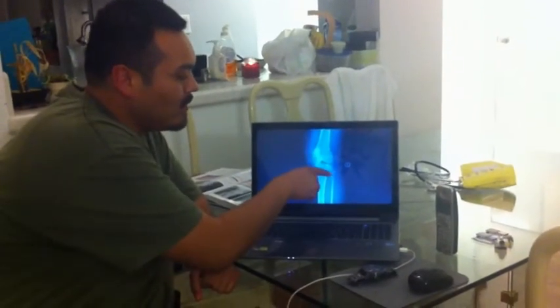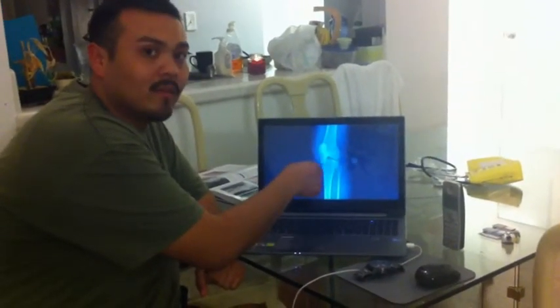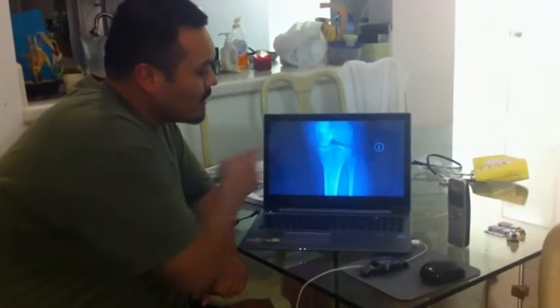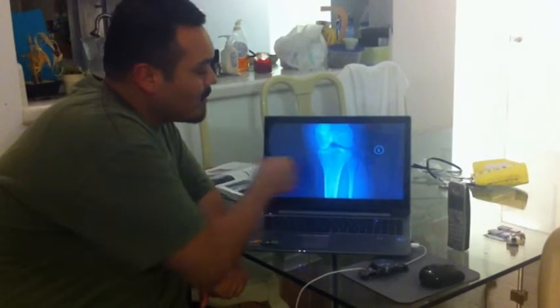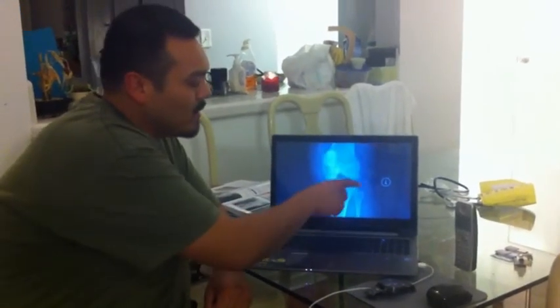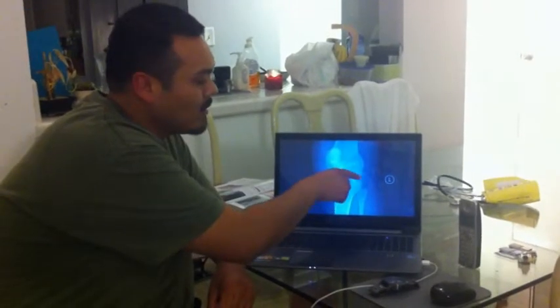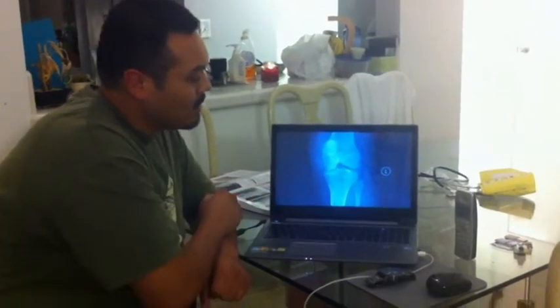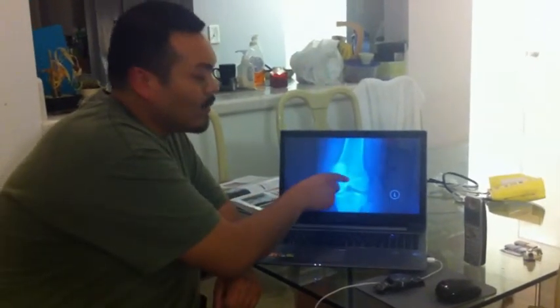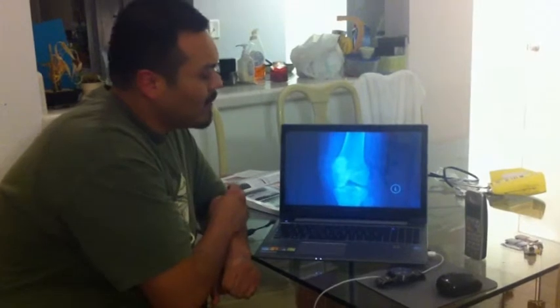of the tibiofibular articulation joints, which would be this one right here, and you can see it fairly clearly. You got your tibia here, your fibula here, and then you have your articulation joint coming right in here. Your lateral tibial plateau would be shown here in profile, and your medial would be right over here on this side. Your patella will not be perfectly superimposed above the femur.